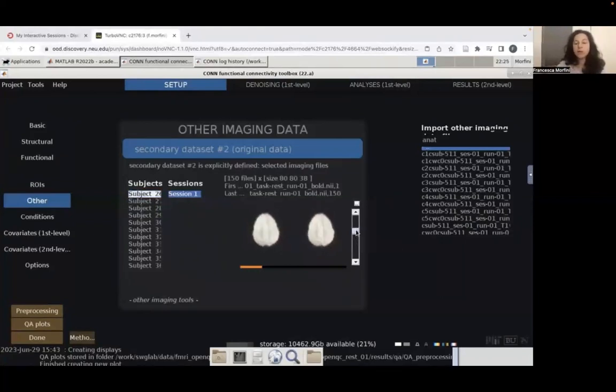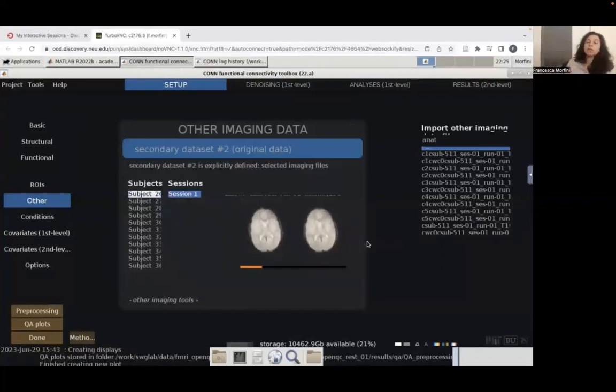To some extent, at the raw data level, this may not necessarily warrant exclusion, especially because this type of heterogeneity is really a participant-level characteristic that is somewhat expected. And so one could decide that perhaps preprocessing and denoising the data is a good way to move forward.